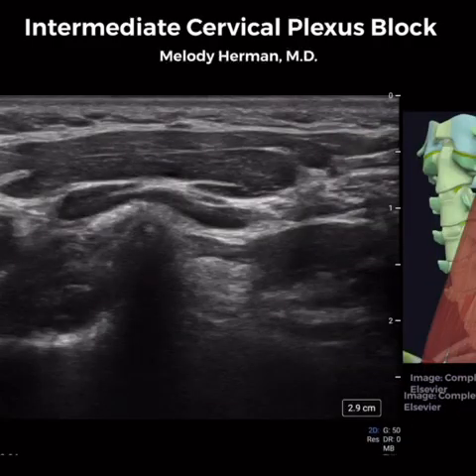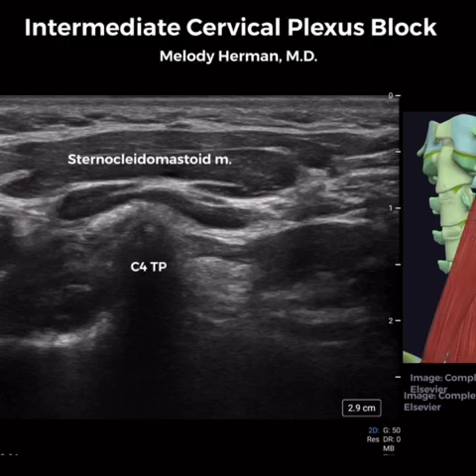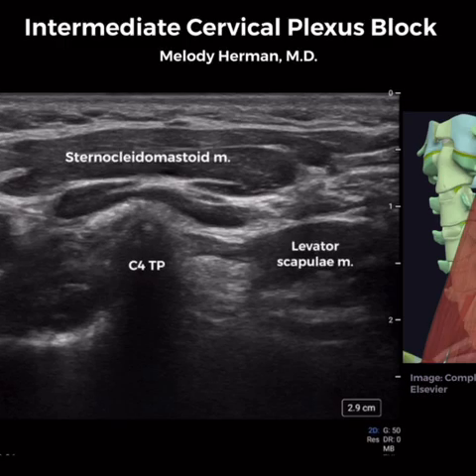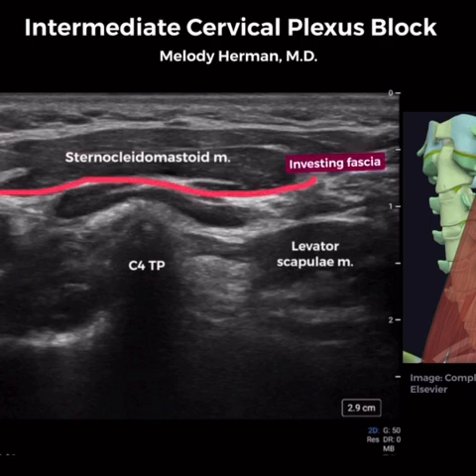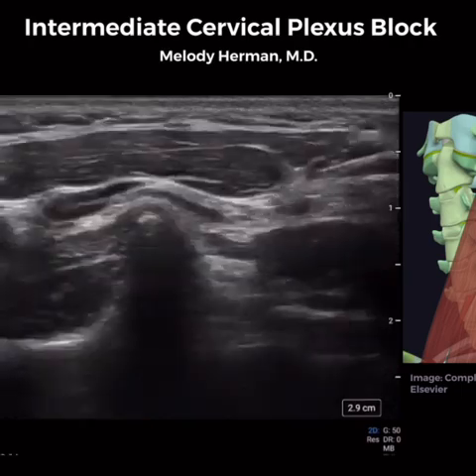At the C4 level, we see the C4 transverse process, the sternocleidomastoid muscle, and the levator scapulae muscle. Posterior to the sternocleidomastoid muscle we have the investing fascia, and superficial to the levator scapulae muscle we have the prevertebral fascia.